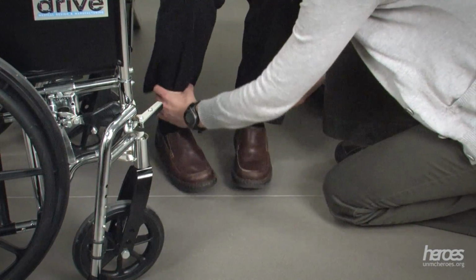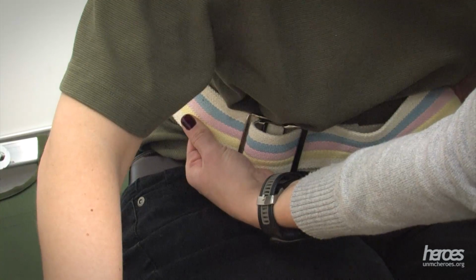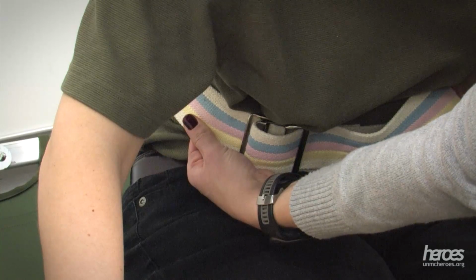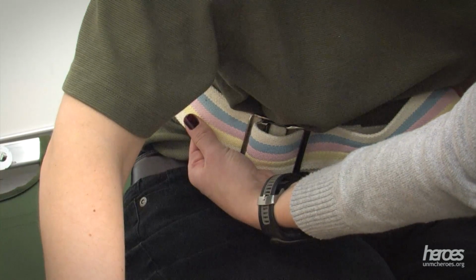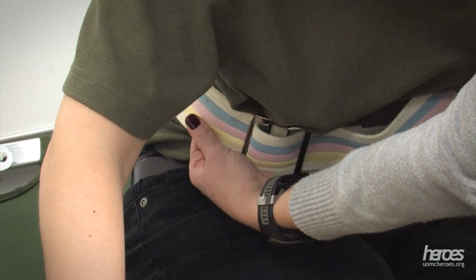Next, position the individual's feet flat on the floor in front of the wheelchair. Then position yourself slightly in front and near the side of the individual with both your hands on the gait belt using an underhand grip.